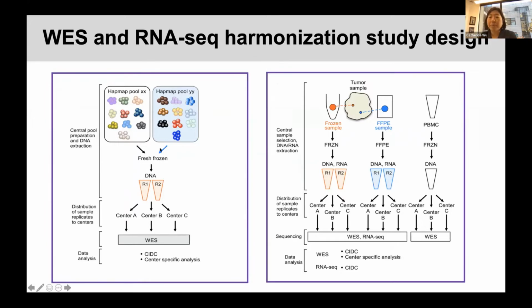A second flavor of experiments was actually to go to actual patient samples, and so the group at MD Anderson, the MD Anderson CIMAC was able to identify 8 tumor specimens from patients with non-small cell lung cancer. And these were specimens that were selected because there was sufficient tissue to compare not only the freshly frozen sample, but also paired FFPE. Now, obviously from the same sample, these were biopsied at different points in the tissue, but it allowed us to start to make those types of comparisons.